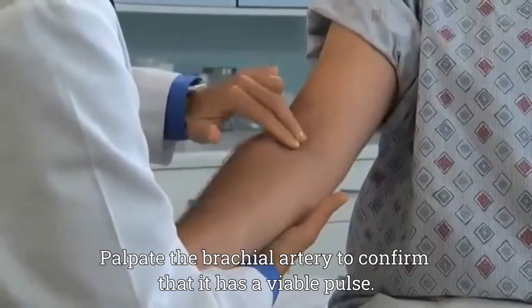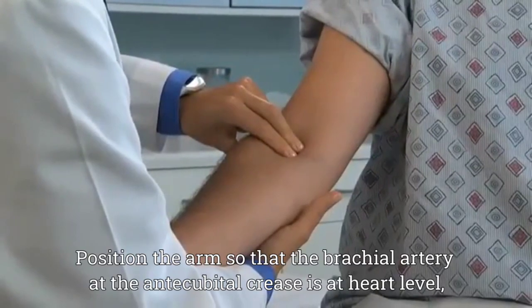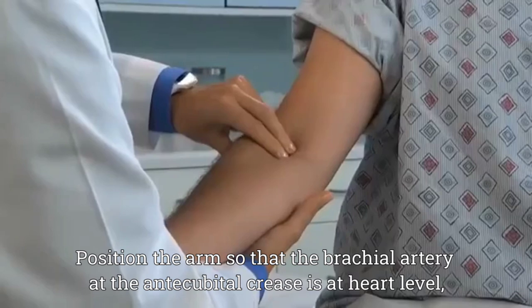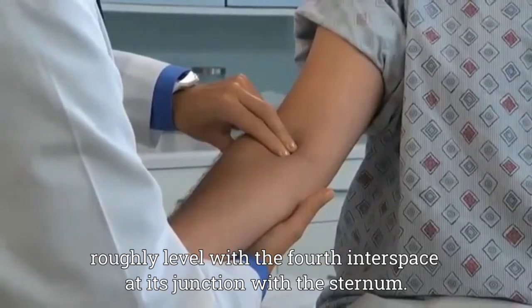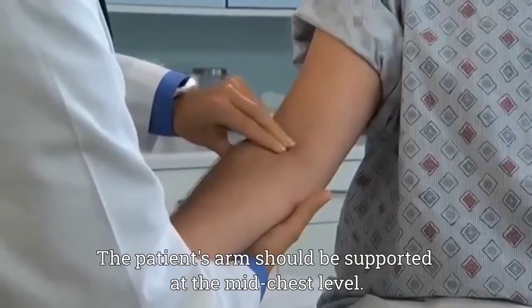Palpate the brachial artery to confirm that it has a viable pulse. Position the arm so that the brachial artery at the antecubital crease is at heart level, roughly level with the fourth interspace at its junction with the sternum. The patient's arm should be supported at the mid-chest level.